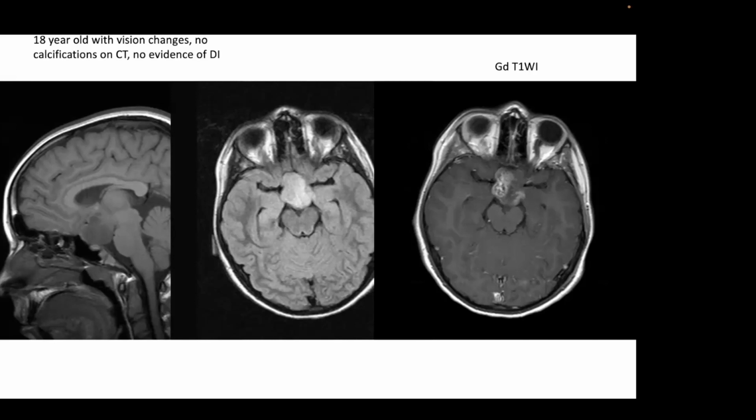If you see the pituitary gland, you should probably move macroadenoma not just down to the bottom of the list, but maybe off the list. So again, this is something that I've seen over the years, is that people will oftentimes move to the diagnosis of macroadenoma because it is so very common, and move away from other diagnoses. And the surgeons will go in, and I can tell you they're not happy when we call it a macroadenoma and they operate and do a transsphenoidal approach, and then the first thing they see is the normal pituitary gland.